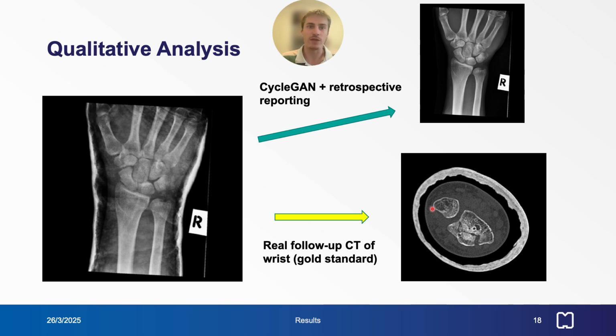In terms of those that differed, one radiologist identified a non-displaced fracture of the proximal pole of the scaphoid bone. And although all 3 radiologists had correctly diagnosed the distal radius fracture confirmed by the follow-up CT scan, the report in that stated that the scaphoid is normal.